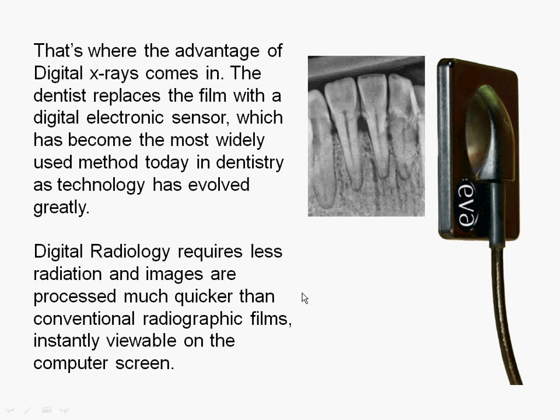That's where the advantage of digital X-rays comes in. The dentist replaces the film with a digital electronic sensor, which has become the most widely used method today in dentistry, as technology has evolved greatly. Digital radiology requires less radiation, and images are processed much more quickly than conventional radiographic films, instantly viewable on the computer screen.